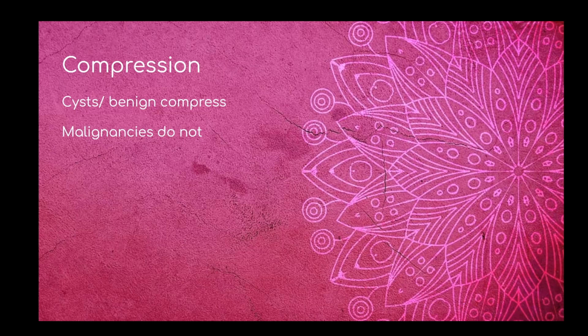Compression is another tool that you can use. When you're scanning the breast, you're going to be using a moderate amount of pressure to be in contact with the breast tissue. If you come across a lesion, try squishing it. Usually benign and cystic structures are going to be squishy, whereas malignant structures are not. Of course, you're then going to label your picture with and without compression and see if there's any change to the shape or size of the lesion.